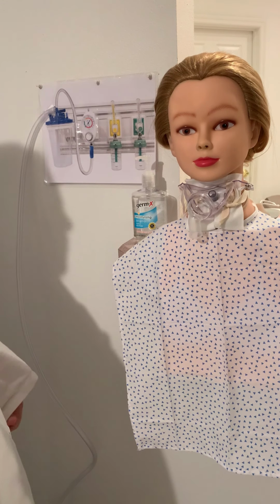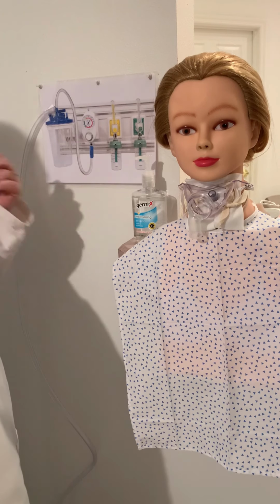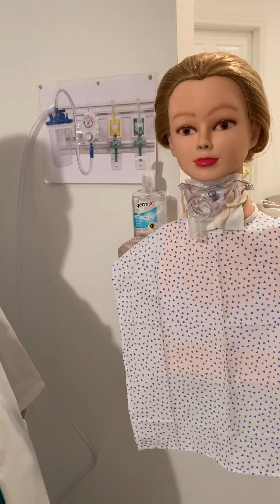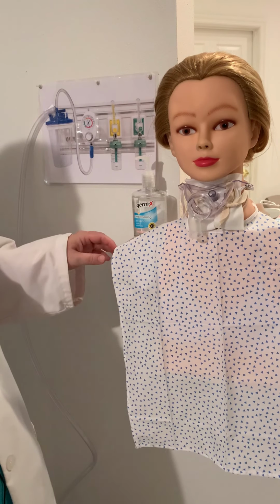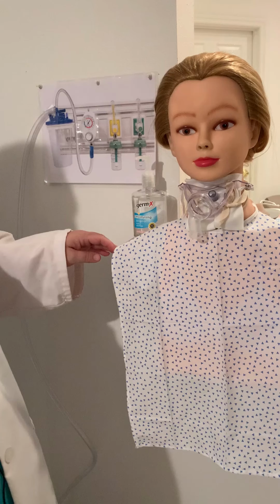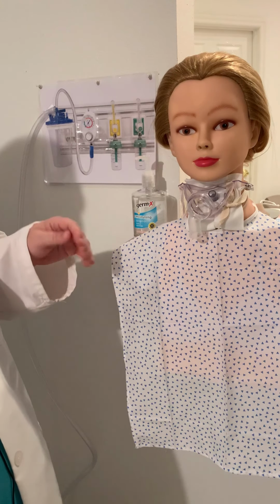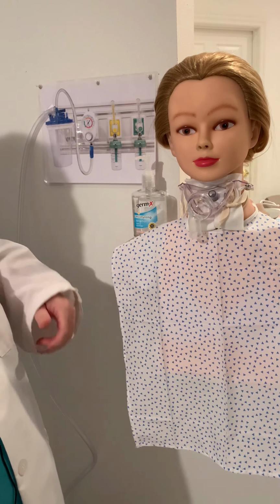So I'm going to provide for privacy. I'm going to close the door to the room or pull the curtains if needed. And then we'll explain the procedure. So Mrs. Harper, I am thinking your trach probably needs to be suctioned. So we're just gonna take a suction catheter and suction that out for you.